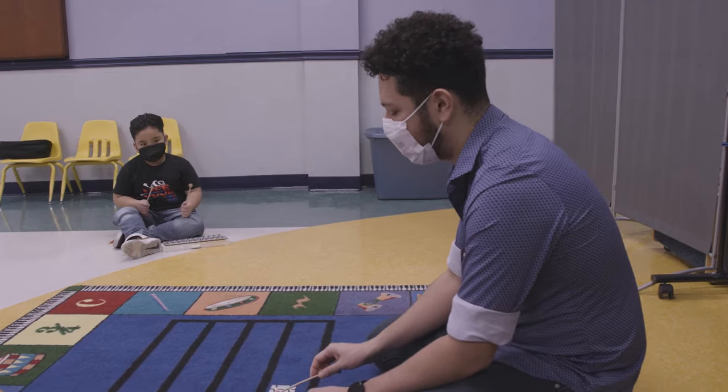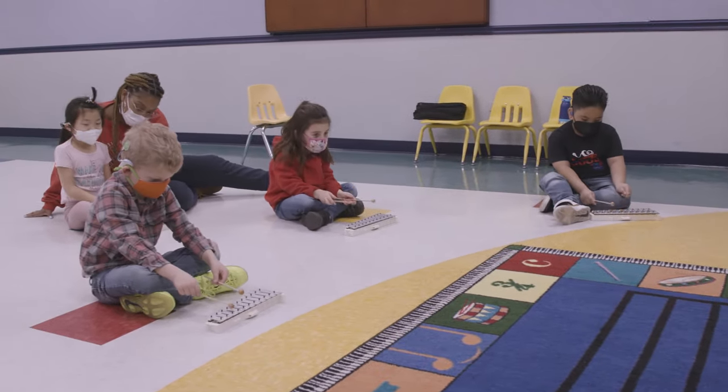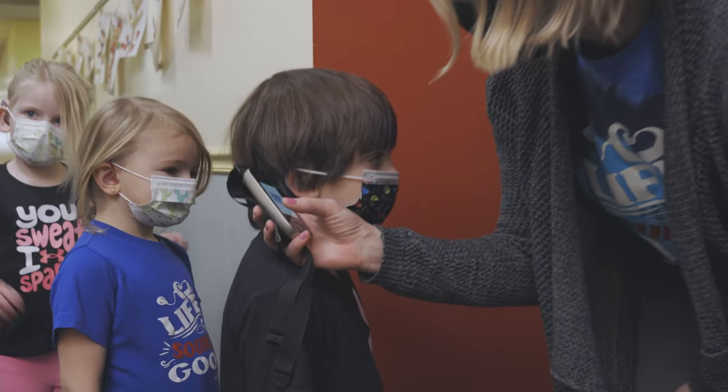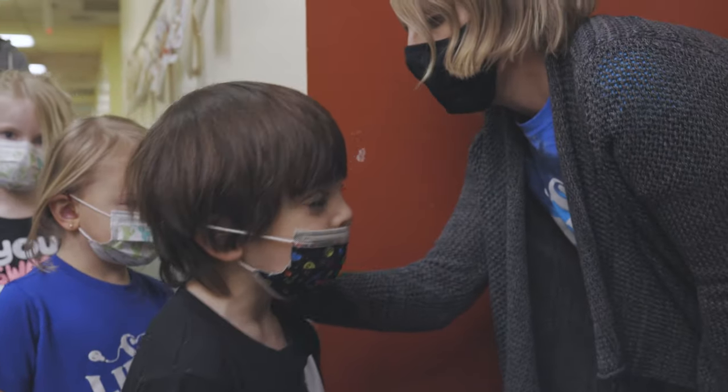It makes the day much easier. They don't have to stop, have the children attach their boots and receivers, sync them, and then at the end of the day do the opposite. The kids just come in, they're connected, and they're on their way.